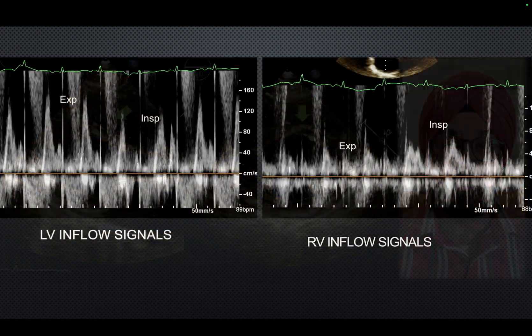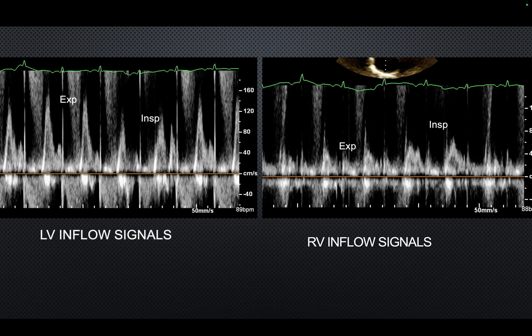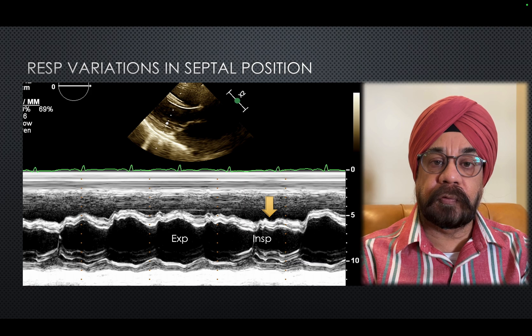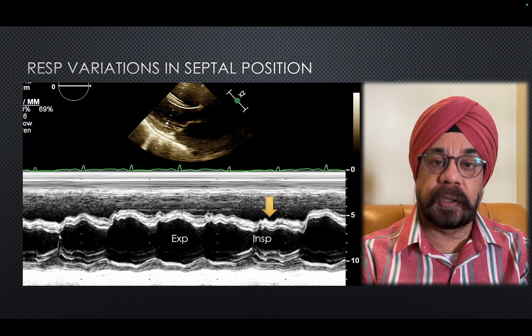Respiratory phasic variation is a very characteristic hallmark of constrictive pericarditis which differentiates it from restrictive cardiomyopathy. There are increased inflow velocities during expiration in the LV, and on the RV there are increased inflow velocities during inspiration — that's the key difference. This is a very important and specific sign of constrictive pericarditis. You also see the movement of the interventricular septum during respiration — the septum moving towards or away from the LV during inspiration and expiration.